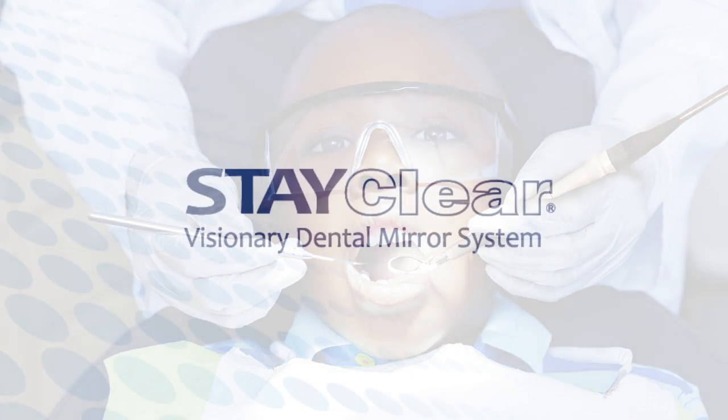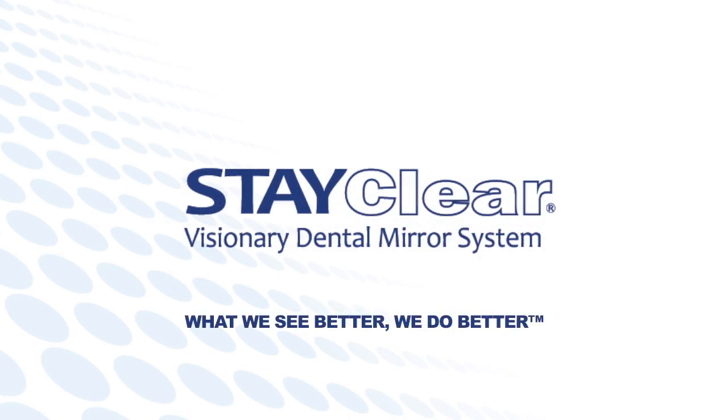The StayClear Visionary Dental Mirror System. What we see better, we do better.